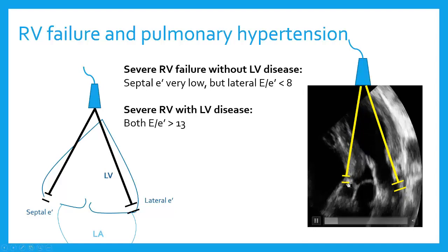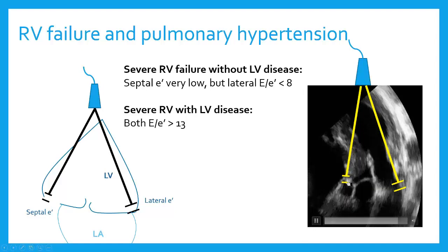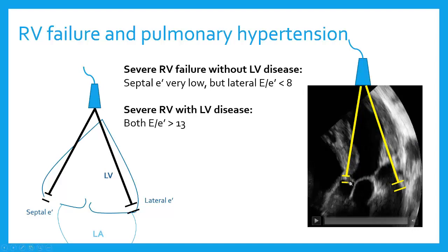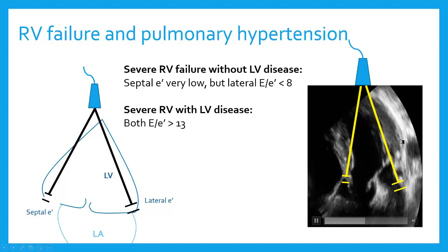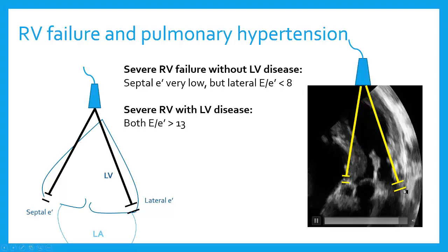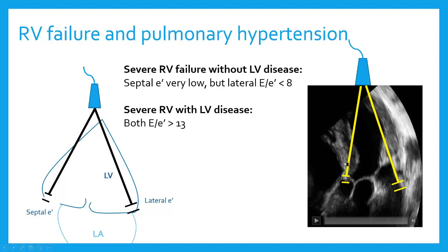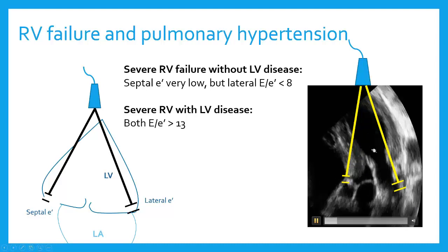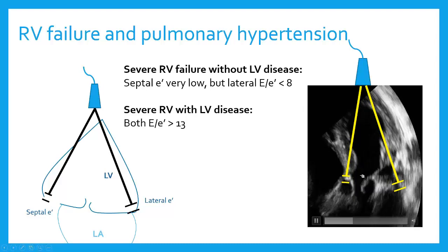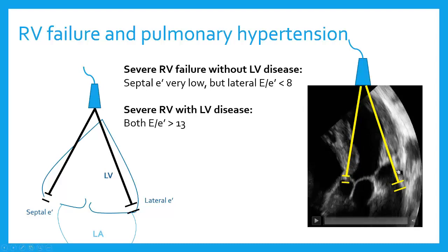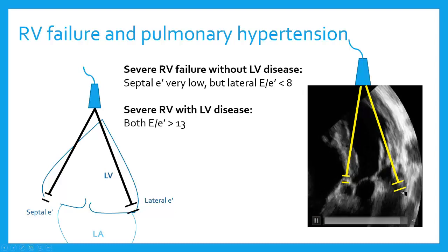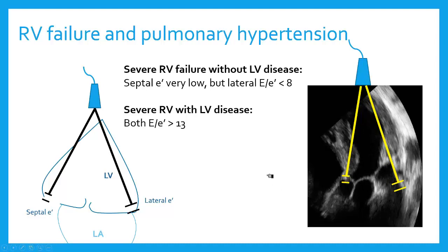However, if both E to E-prime velocities — my septal and my lateral — are high, then I'm really dealing with right ventricular failure probably mostly due to left ventricular failure. This patient has very little septal movement, so the septal E-prime velocity won't be much. She actually had significant left ventricular diastolic dysfunction as well, so her lateral E-prime velocity is pretty diminished too. She had a huge RV with paradoxical septal movement. The question is: is it primary pulmonary hypertension (groups one or three) or is it group two disease? We can say it's probably some degree of group two disease because both lateral and septal E-prime velocities are quite low.